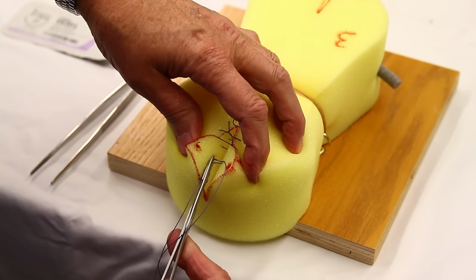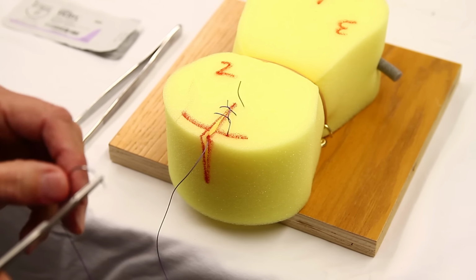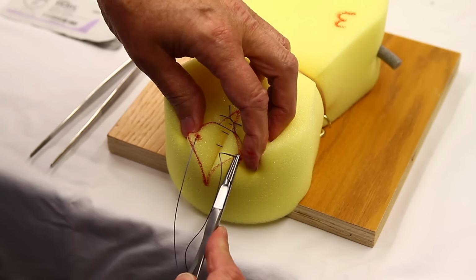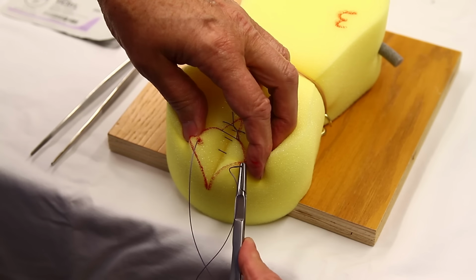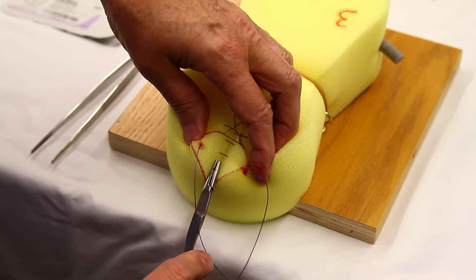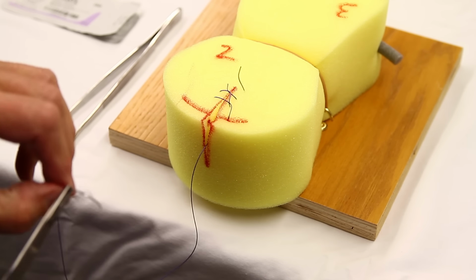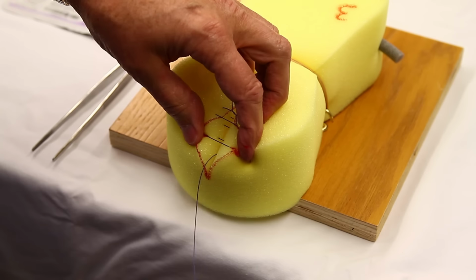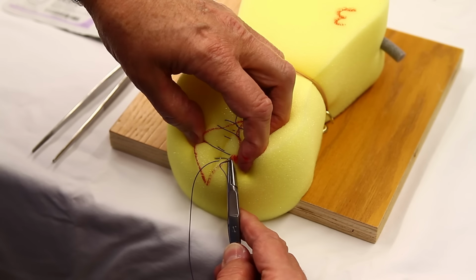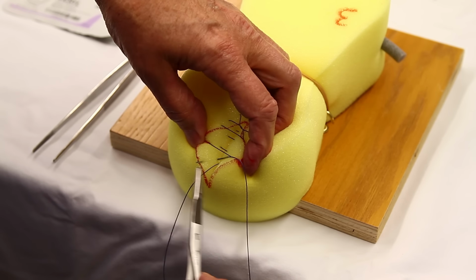That's the perineal body. These are not locking. Carry it across. And again, this one goes all the way across to the other perineal body and deep into the laceration. This is where you move forward, which means in this direction to advance your repair. You don't have to pull these very tightly or snug them up later. There's always a little edema in the perineal area postpartum, so you don't want these to be overly tight. Go straight across, come up a couple millimeters from the surface of the skin, like that.